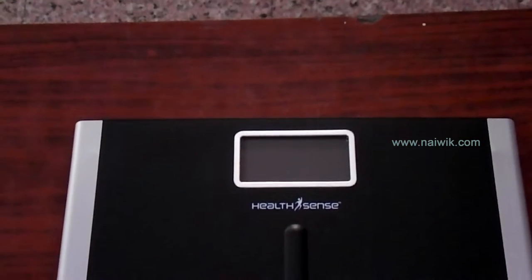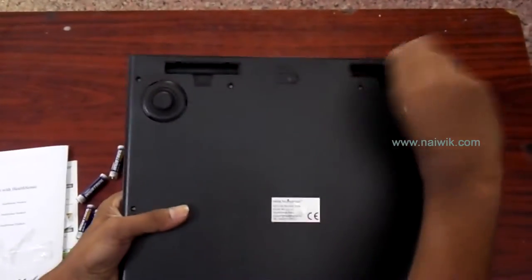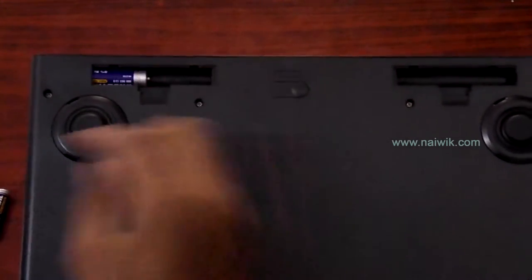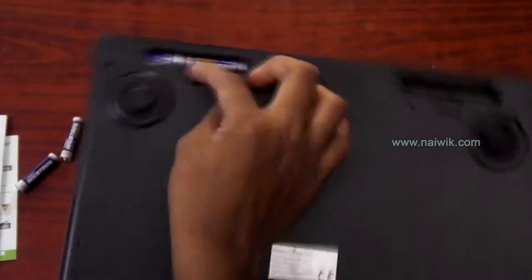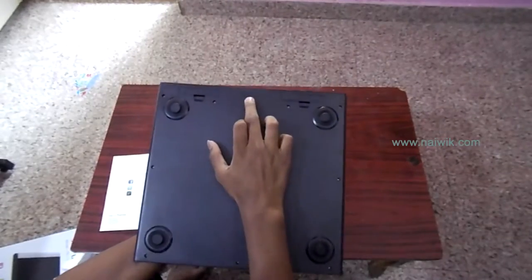Here is the HealthSense weighing scale. Let's try to insert the batteries and test the product. We need to remove the back cover and insert four batteries — two batteries on one side and two batteries on the other side, as you can see on my screen.